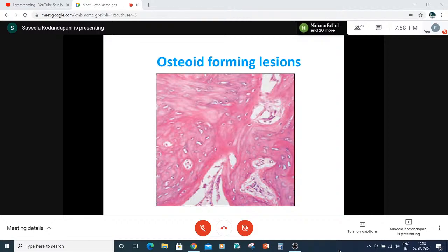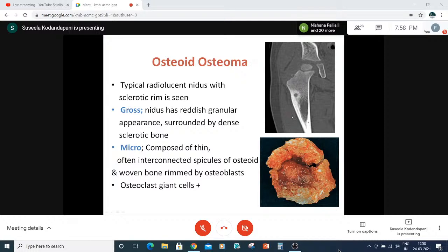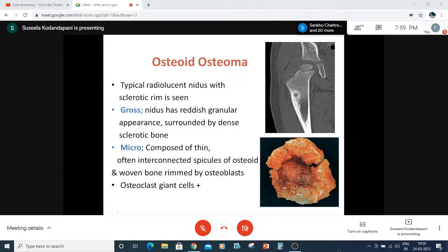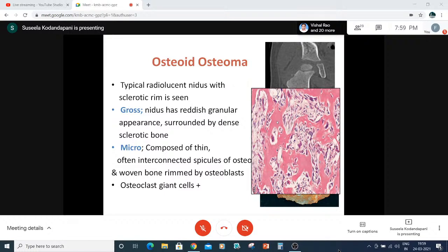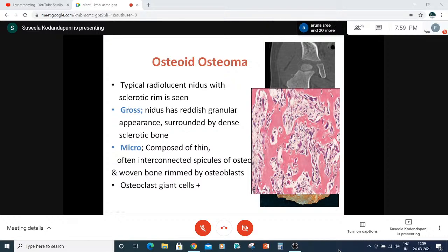Osteoid-forming lesions: osteoid osteoma is an X-ray diagnosis showing a nidus in the bone — a typical radiolucent nidus with a sclerotic rim, which is reflected grossly as a sclerotic rim with a central reddish granular appearance. Microscopically, it is composed of thin interconnected spicules of osteoid and woven bone rimmed by osteoblasts. We may commit the mistake of calling it osteosarcoma — to differentiate, look for pleomorphism and mitosis. In osteoid osteoma, the bone texture is mature; in osteosarcoma, it is immature. Osteoclast giant cells may be seen here and there.